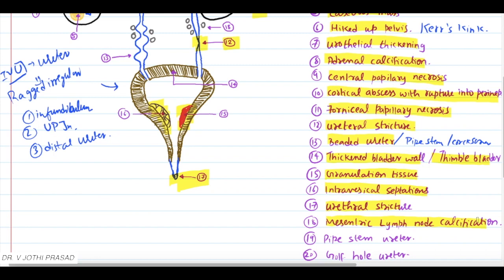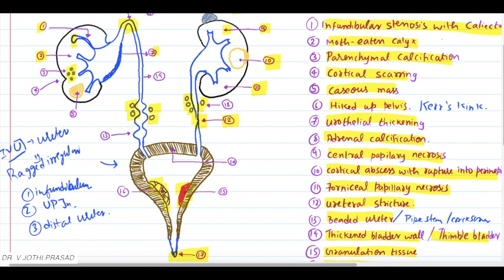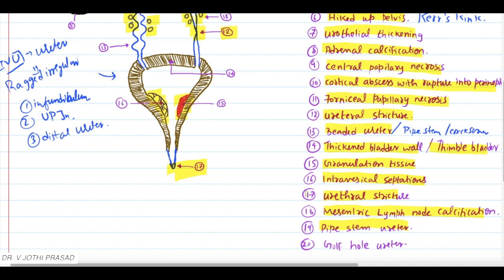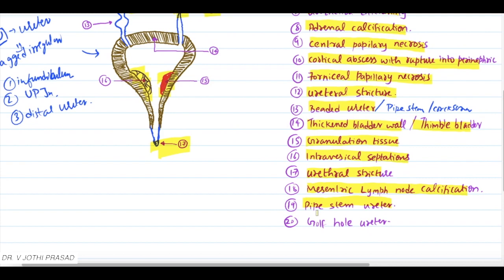The 18th finding is mesenteric lymph node calcification. This is a classical CT finding - you can see multiple mesenteric lymph nodes adjoining the ureter, calcified and causing obstruction of the ureter. The 19th finding is pipe-stem ureter. You can see the pipe-stem appearance of the ureter here.